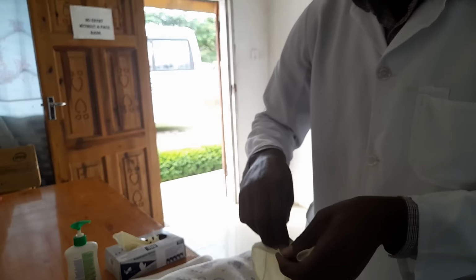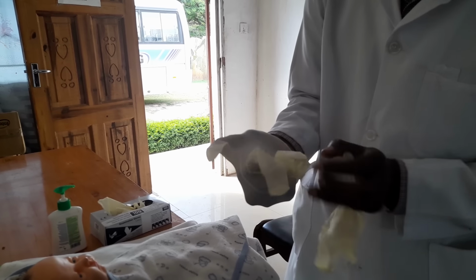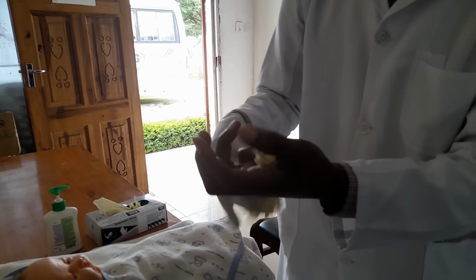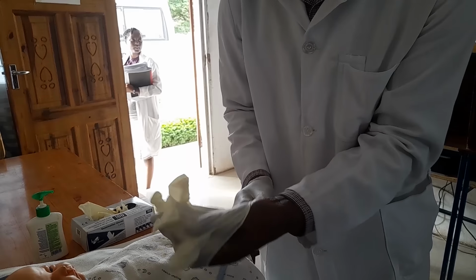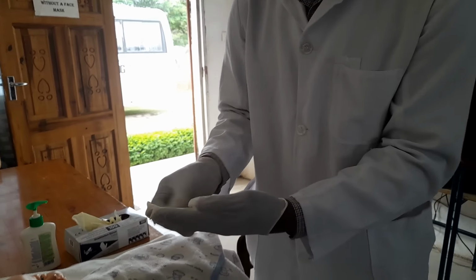After you do that, you're going to wear gloves. Because this is a newly born baby, you're not going to touch a newly born baby with bare hands because of infection prevention issues. Once you do that, you should quickly go to the resuscitator and switch it on.